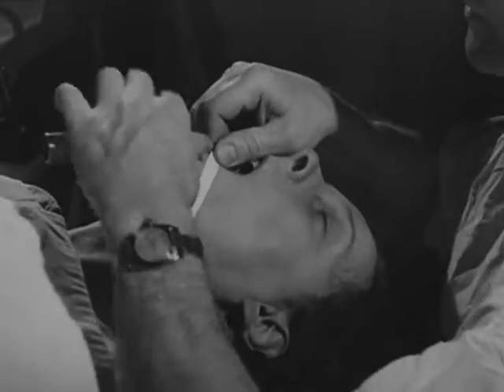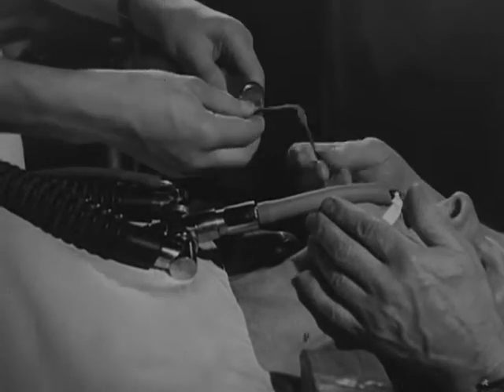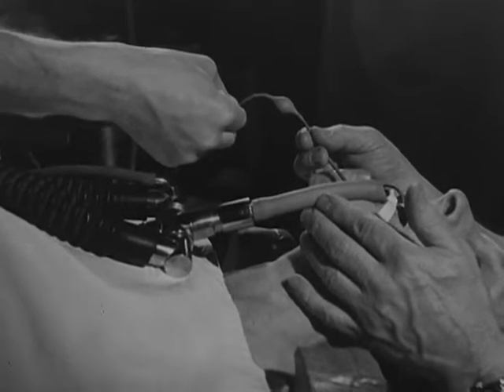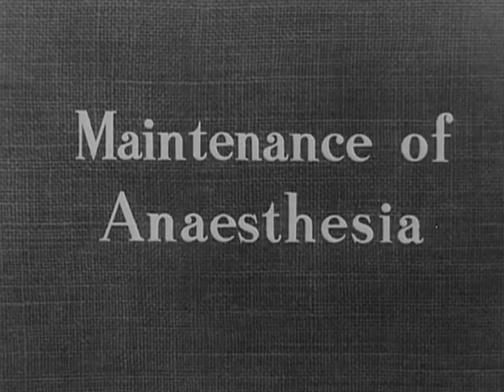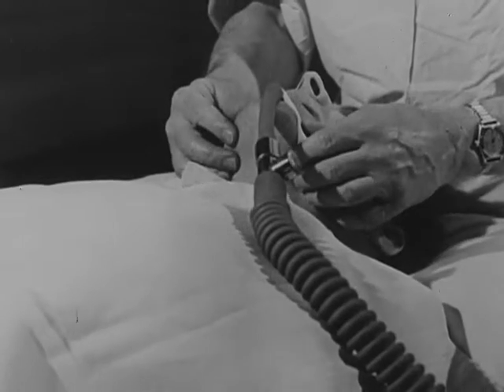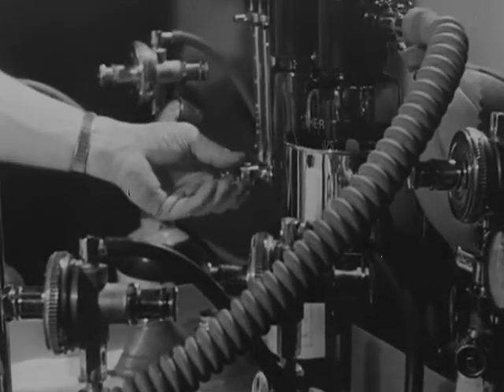The anesthetic machine is attached, and then the cuff is inflated. The pilot bulb indicates the state of inflation of the cuff. With the tube in, anesthesia can now be maintained by ordinary inhalation methods. Often the anaesthetist has to control the administration from a distance. Any efficient machine will do, and the system may be open or closed.